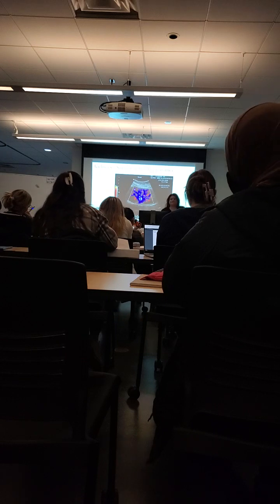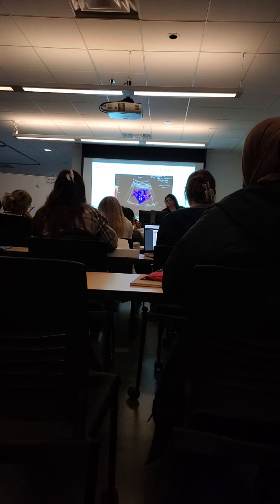You want to show that the vessel is penetrating and going in, and it's going all the way out here to what we call the arcuate. I didn't add the vessels for this lecture because I don't really need to. You're going to learn that in Rain's class. But if you need some help with it, let me know.